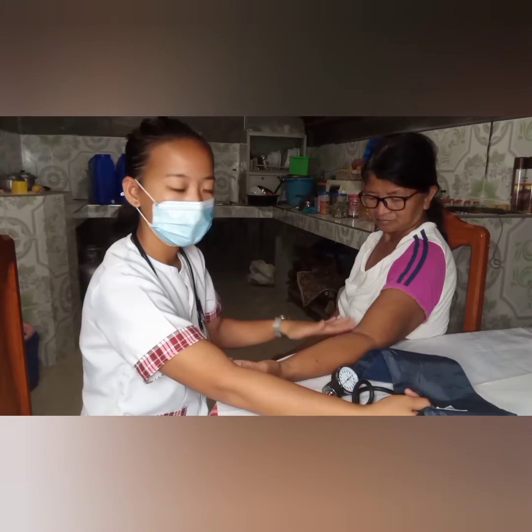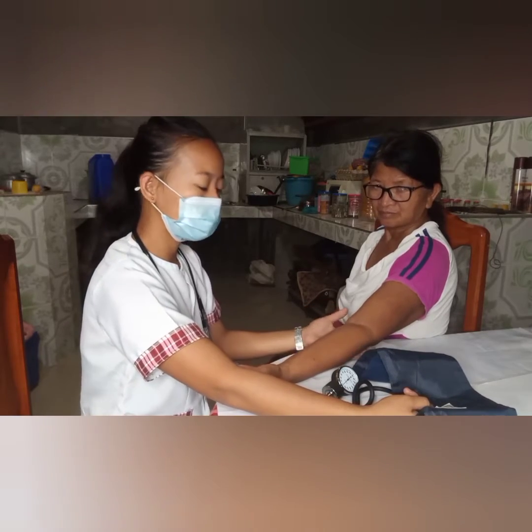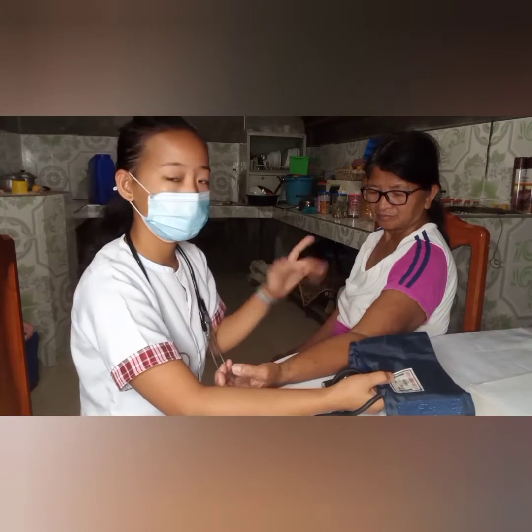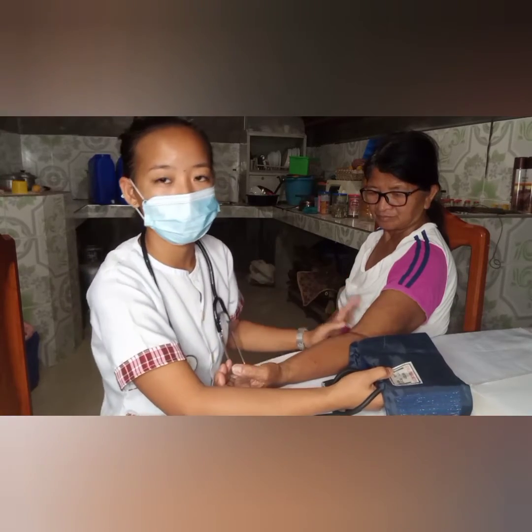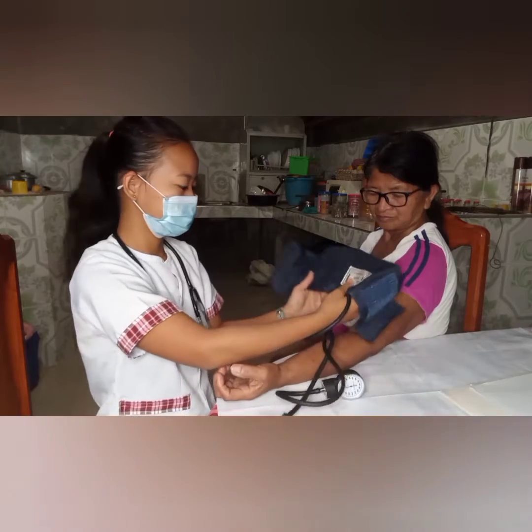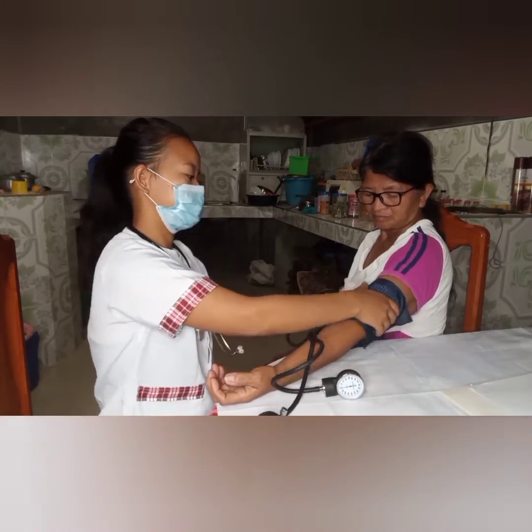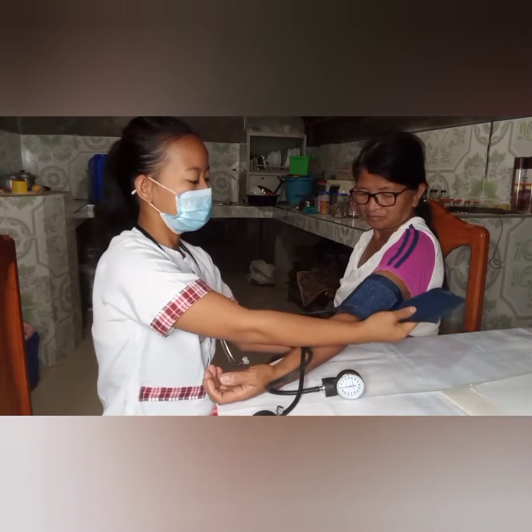Here on this part is where we can hear properly the pulse rate or the blood pressure rate of the patient. We'll be putting it over like that and close it properly.